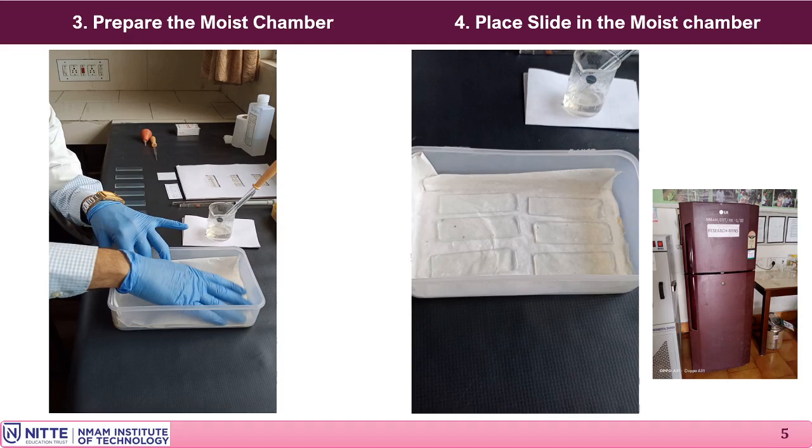This facilitates uniform distribution of ions which were there in the buffer, and these ions will distribute evenly in the agarose. In addition, by keeping the chamber in the cold condition, the agarose will harden and it becomes more solidified. Therefore, it will be easier to handle it because when punching, it will not crack.